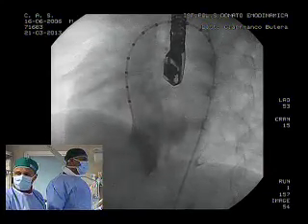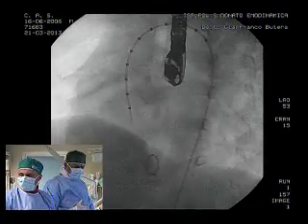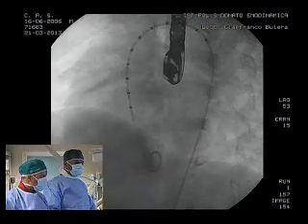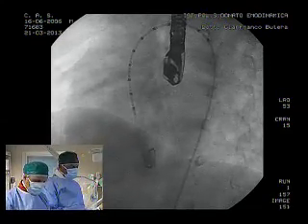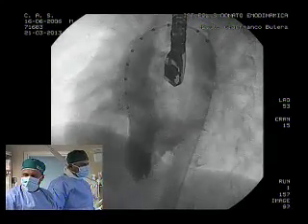So, we're going to proceed, guys. After my discussion with Gianfranco as well, we are going to use a 5 millimeter membranous VSD device and see how it will sit. Obviously there is a fear that it will pull through to the right ventricle. We're going to try this and give it our best shot and go from there.